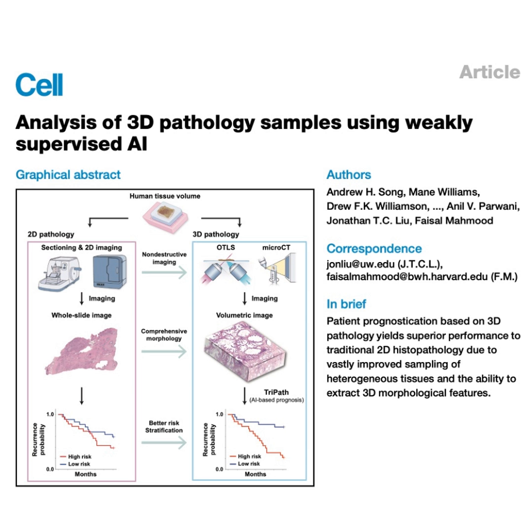We kind of know this already, right? Pathologists often get better results if they look at multiple levels cut from the same block. That tells you something. Okay, so more slices help. Yeah, but it's more than just missing a bad spot. A lot of the important microscopic structures, things like how glands are branching in 3D or the actual shape of cell clusters, they can look really ambiguous, or you might not even see their true form in just one flat cross-section. You lose the architecture. Like seeing a slice of intricate plumbing, you don't know where the pipes actually go. Exactly. Yeah. That 3D structure is critical for accurate grading, for understanding how bad it really is. You need the whole picture, not just one snapshot.